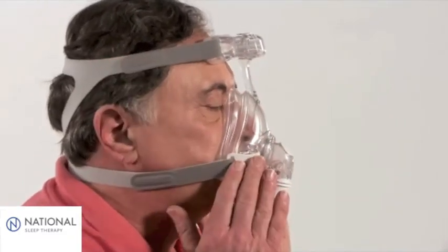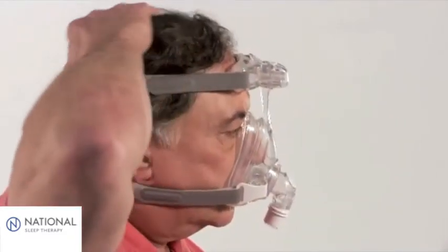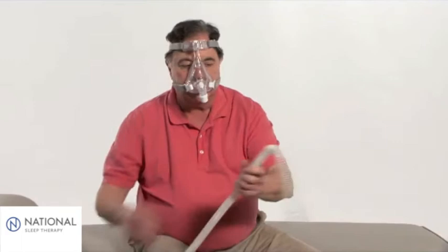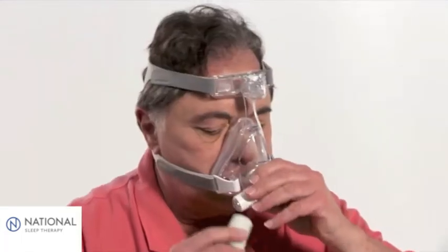Check the headgear to make sure that the straps are parallel and are fully extended and flat across the back of the head. Connect the tubing to the device and to the elbow swivel on the mask.